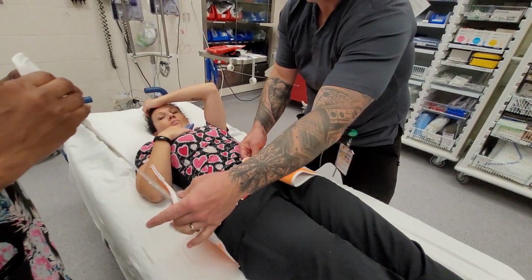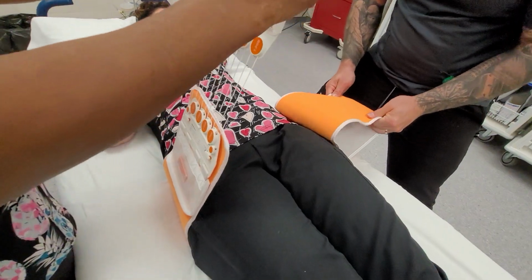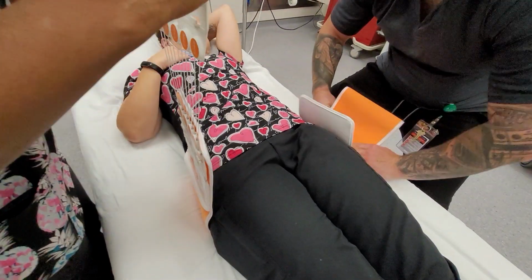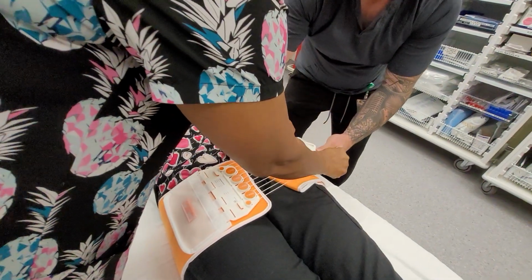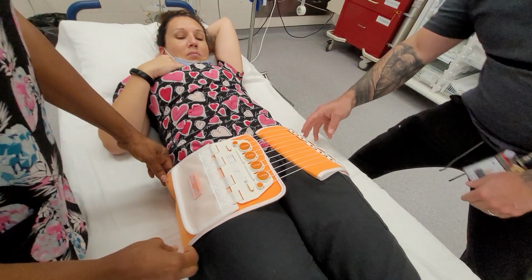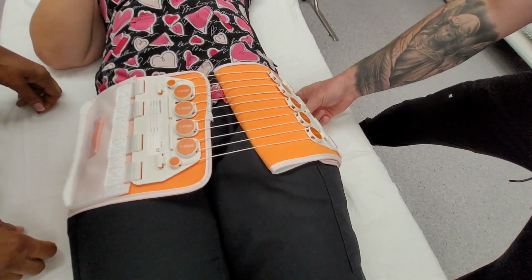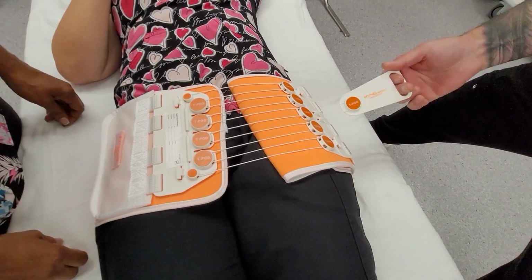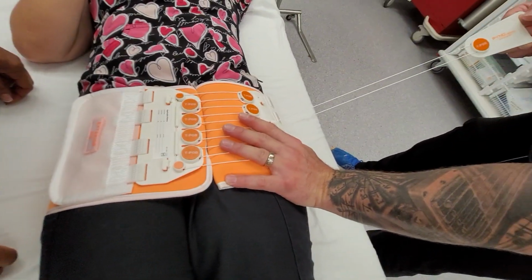Okay, you're going to want a space between the two pieces, so we're going to sort of adjust a little bit. And we're going to go right about there, and then we're going to bring it over, and we're going to just Velcro that piece to the other side. Okay. Then this device here, it's Velcroed onto the binder. You pull it apart, and then you're just going to apply tension.